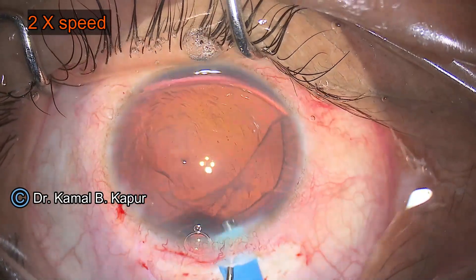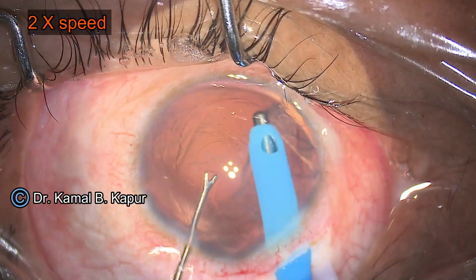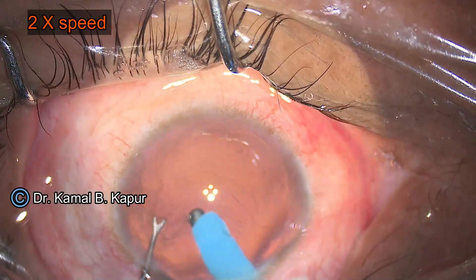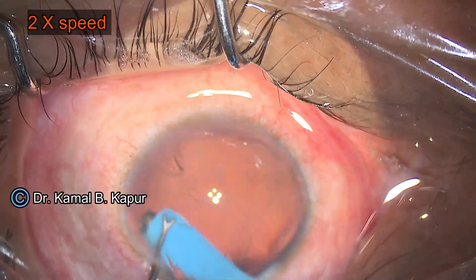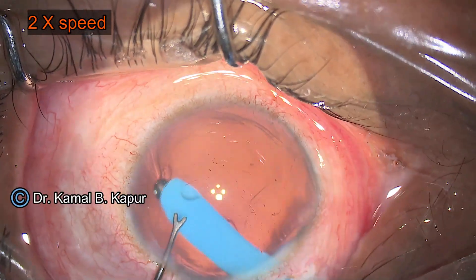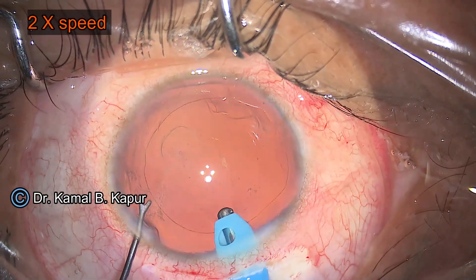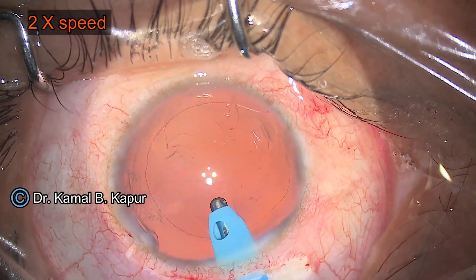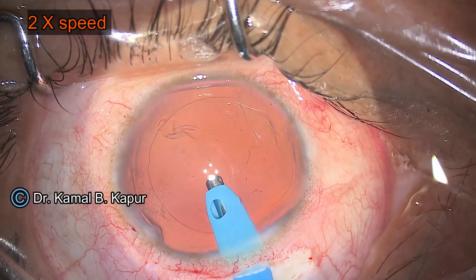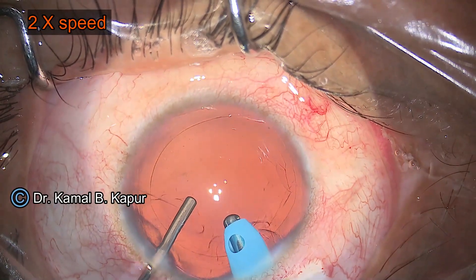Another important thing is to be careful when you come out with your irrigation instrument during surgery, because sometimes the zonules in these patients can be weak. Also, since this is a case of high myopia, pressure changes in the anterior chamber will transmit to the vitreous, which can lead to retinal issues, retinal detachment, or PVD — something to be concerned about at a later point.